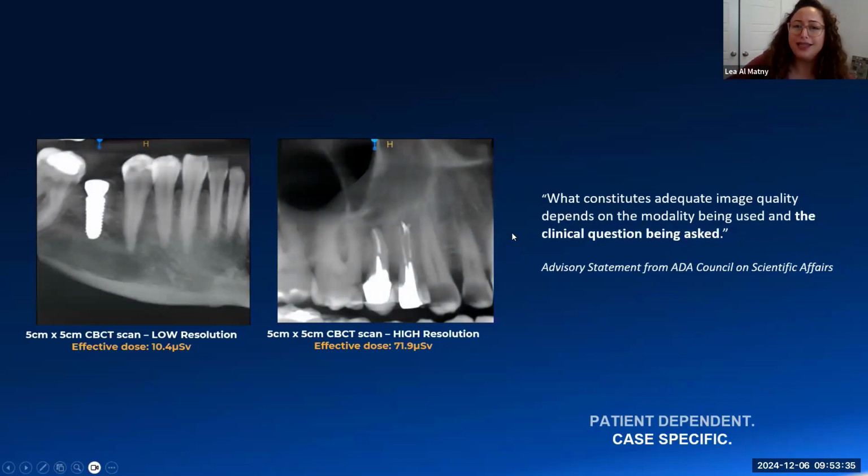You don't have a wide difference between 2D and 3D, so it's easier to set that aside for a bit and only focus on the diagnosis and benefit of the patient. And that radiation exposure will vary depending not just on the machine you're picking or if you're taking a CBCT scan or not, but also on the purpose of the study.